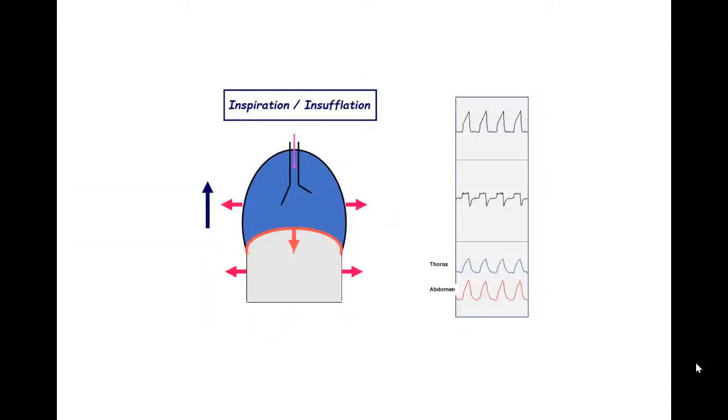So we can go further. We can go further, learning about respiratory muscle fighting during upper airway obstruction without blunting of the central drive. For that, we have to go back to physiology. As you can see on this slide, during normal breathing, diaphragmatic contraction increases simultaneously the thoracic and abdominal diameters. The polygraphic translation of this mechanism shows synchronism between thoracic and abdominal movements.